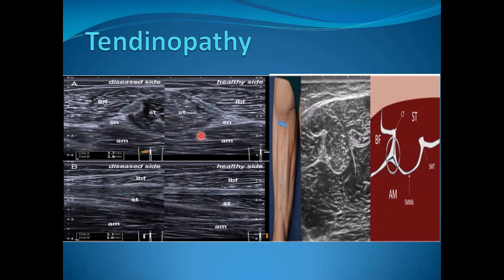In this example of tendinopathy, the healthy side shows the sciatic nerve and common tendon normally. On the diseased side, we notice increased thickness of the common tendon, also noted on longitudinal scan. Knowing the anatomy of this area allows us to pick up subtle pathology.